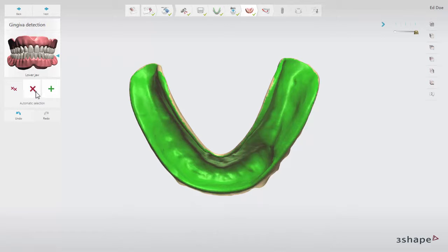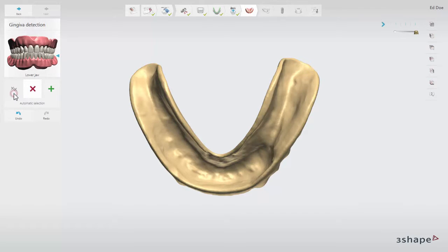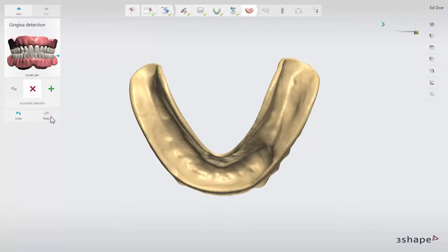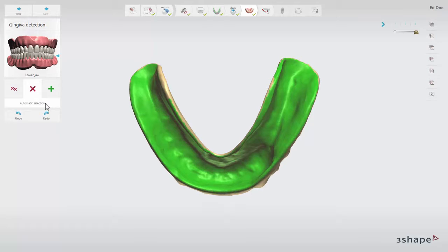To edit the marked area, click the Remove button to deselect it partially. Click the Clear Selection button to remove the whole selection. Use the Undo and Redo buttons to cancel or restore the last action respectively at any step. You can always enforce automatic gingiva detection with automatic selection.